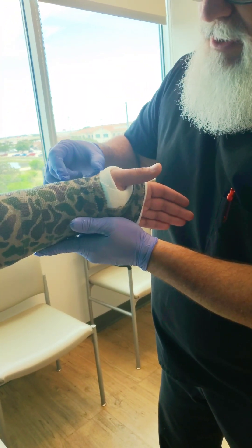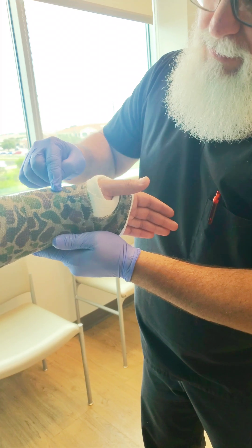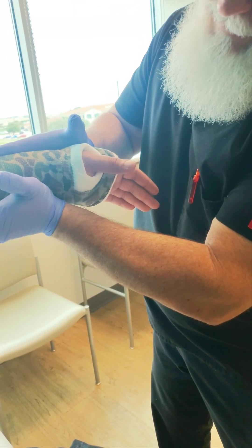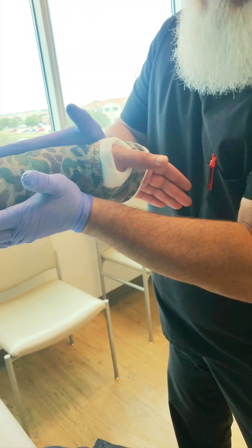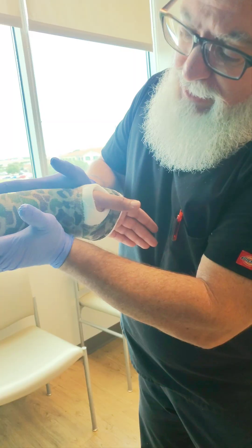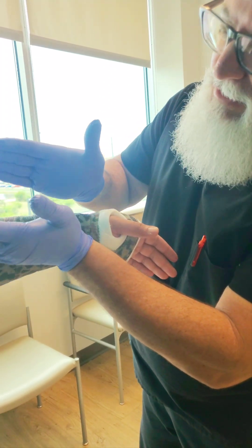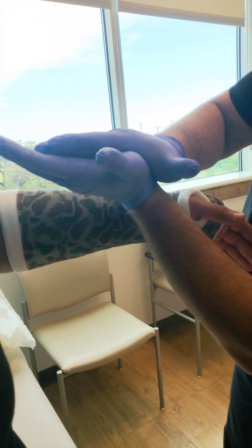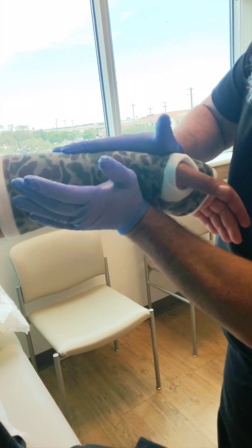The surgeon will measure on the radiology screen and mark wherever they want you to apply pressure for that volar mold — 99% of the time they'll mark it for you. You're going to take the butt of your hand and place it on the palm surface of the forearm or wrist wherever the doctor tells you. Think of making a cup with your hands, with the patient's arm in between — here's the bottom of the cup, here's the top — and you do a volar mold just like that.